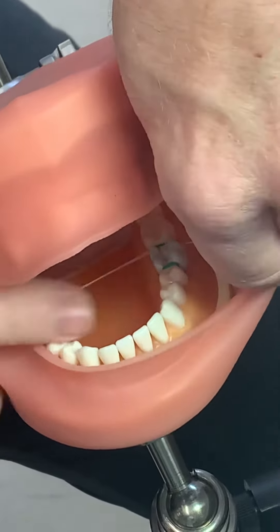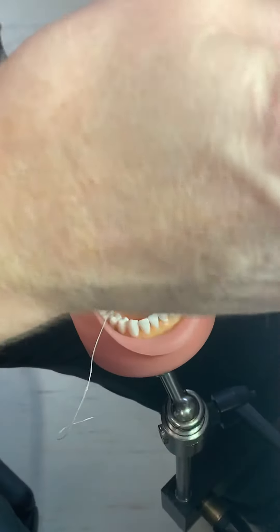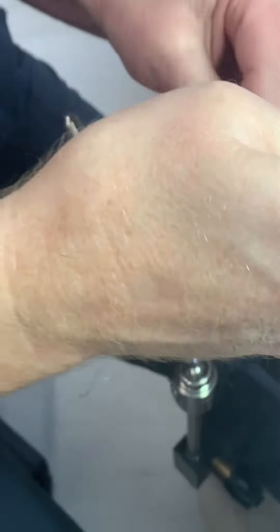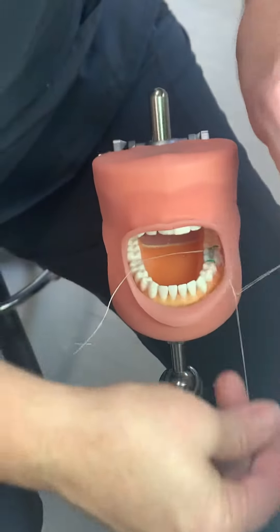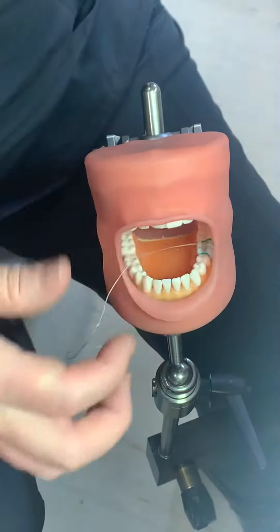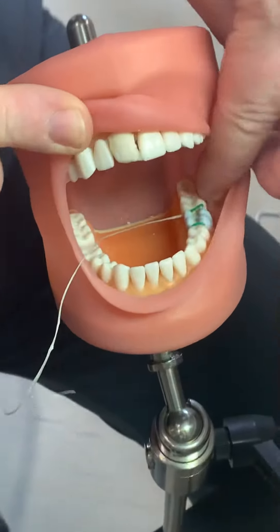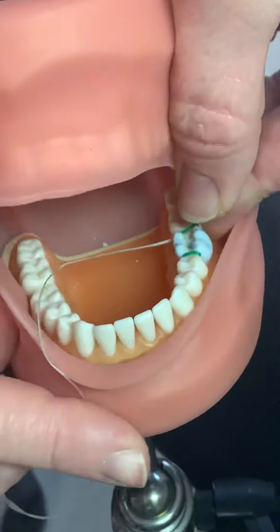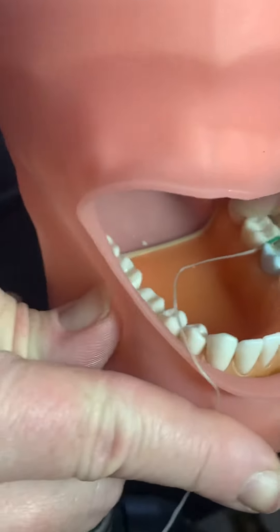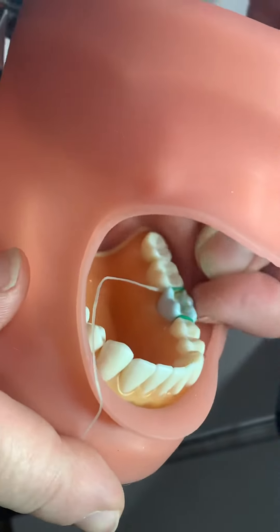I'm going to leave this one to show you how it shouldn't be — look at how far down this one looks compared to this one. On the lingual side it's way down in there. We don't want it to be down that far; we want it to look like this.